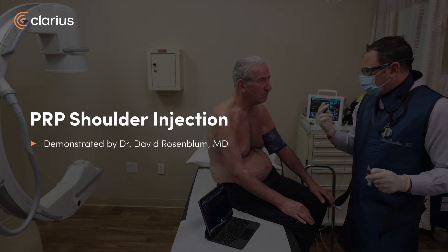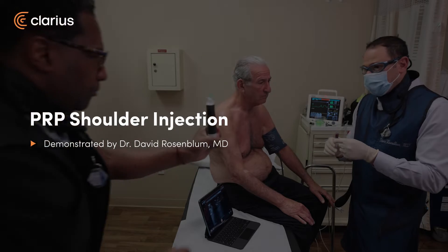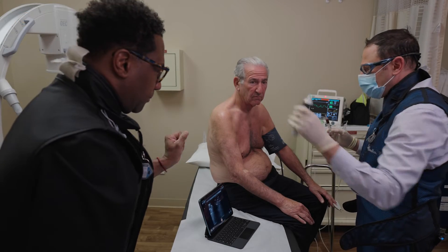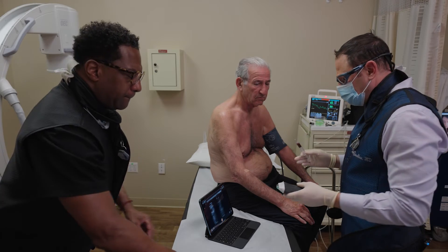Elliot has had three gel shots in his shoulder which have helped him, and now he's opting for PRP injections. I'm going to use the ultrasound to take an anterior approach to the glenohumeral joint and perform the injection.